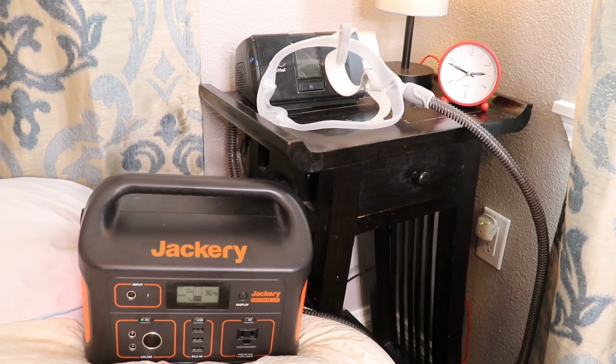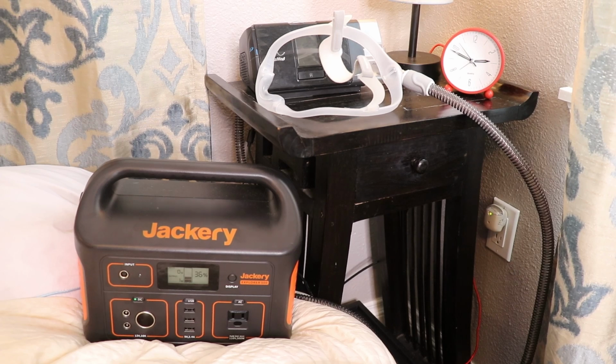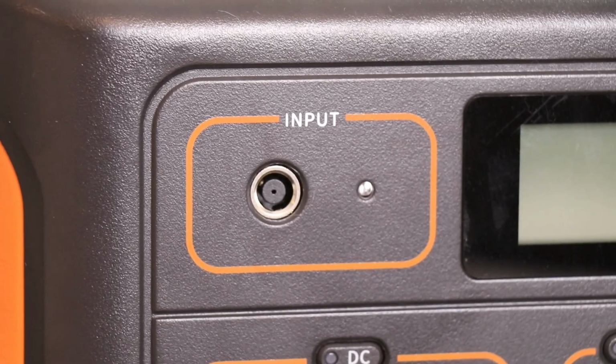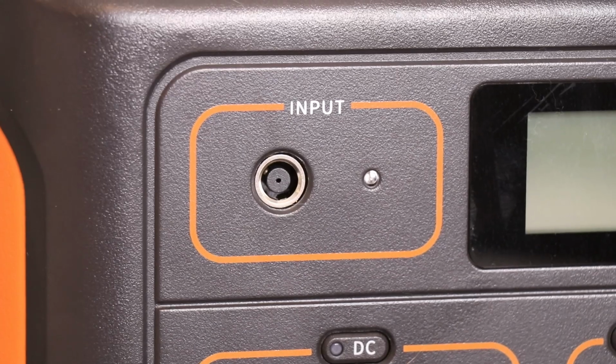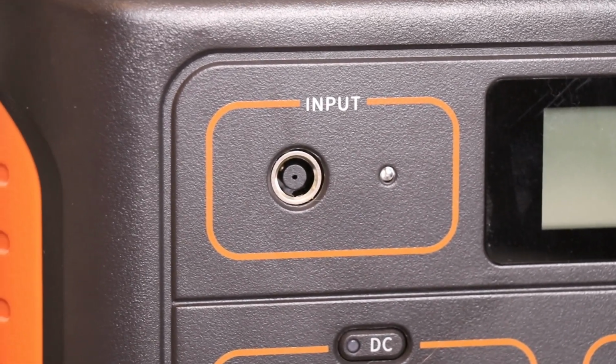Using this setup with the DC adapter and the humidifier and heater turned off, you'll be able to get several days of use out of your CPAP machine to allow you to have a good night's sleep. It takes several hours to recharge the Jackery Explorer 500, so just plug it in overnight to recharge, and when you wake up in the morning, it will be back at 100%.